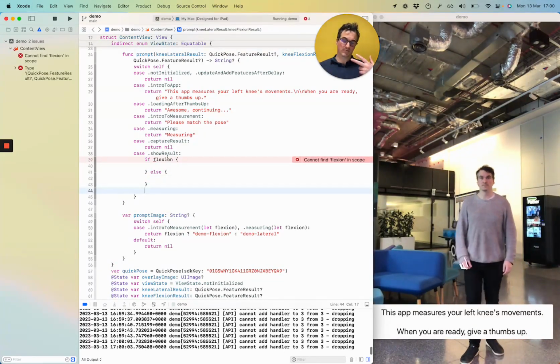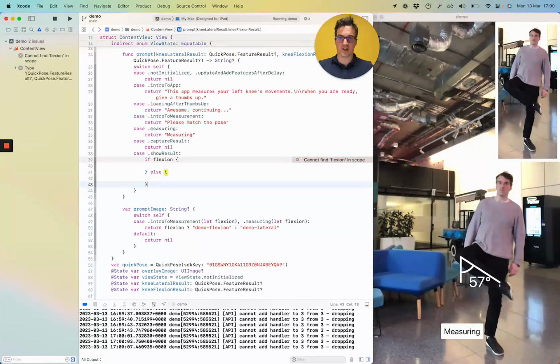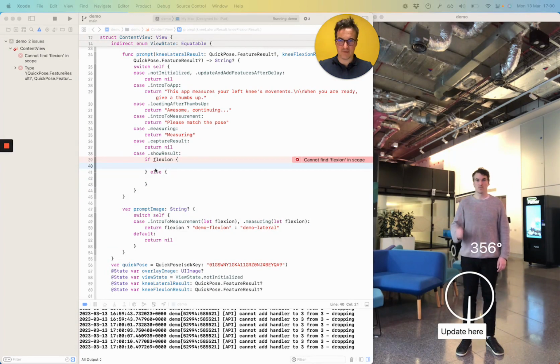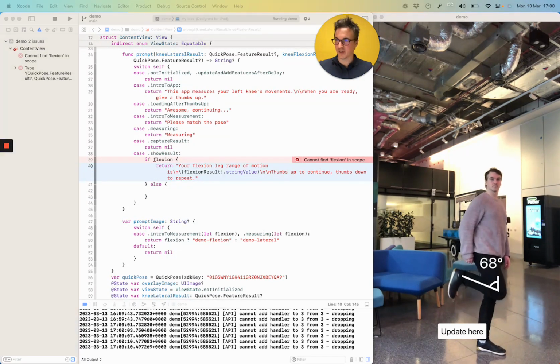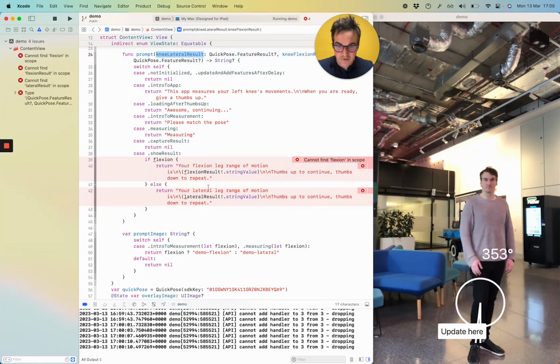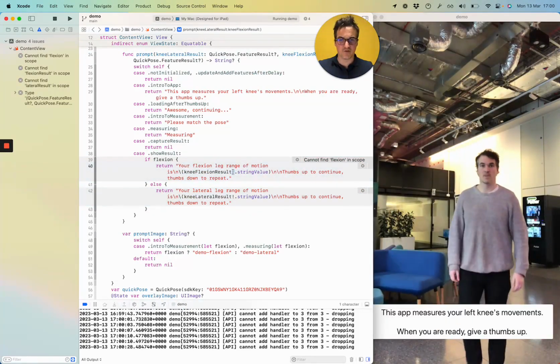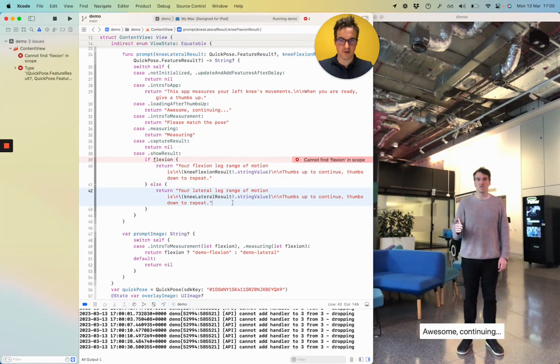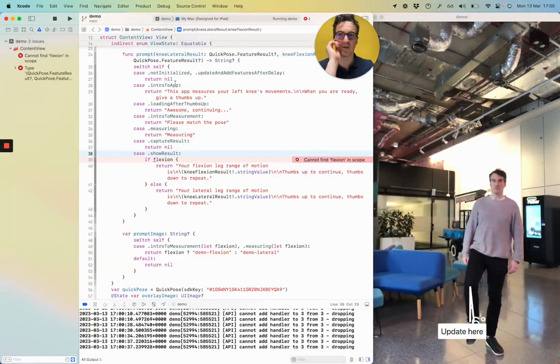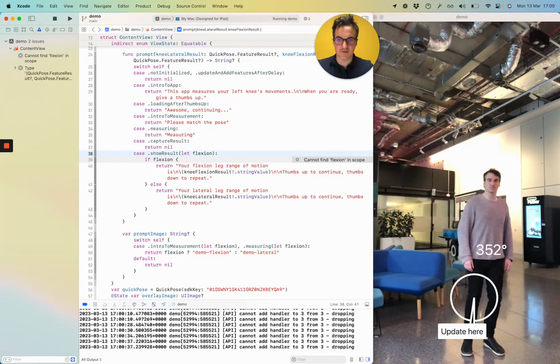And if you were to add more and more values to here, you can do an enum or something a bit more dynamic using a dictionary, say. I'm just going to paste in a pre-prepared response because it is quite wordy. Note here I'm using the results provided from the parameters. I'm doing a sort of forced reference here. This is probably a bit naughty, but it keeps the rest of the interface quite clean. And we're going to only reference the flexion down here.